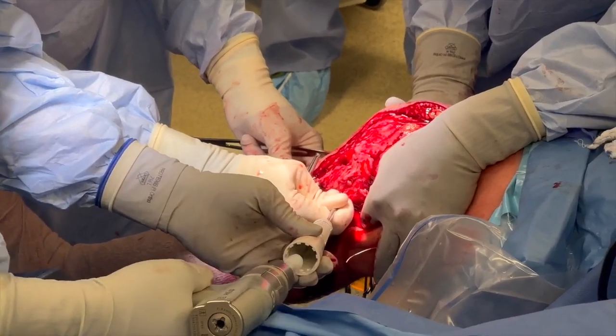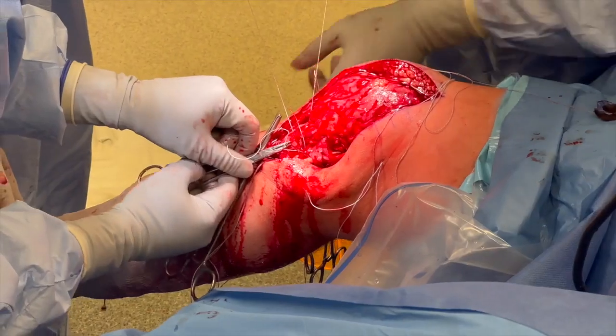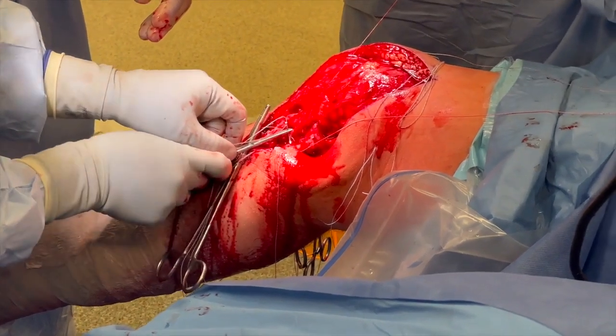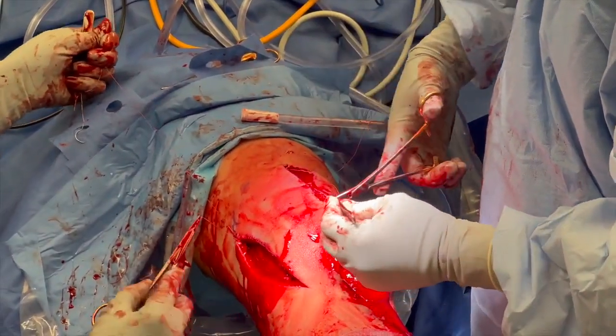To reconstitute the proximal soft tissue tibial attachment of the MCL, a Q-fix anchor is placed 15 mm distal to the medial joint line. The MCL allograft is sutured to the Q-fix anchor with the knee in 30 degrees of flexion. Knee stability with the restoration of the valgus stress and anteromedial drawer test is validated one last time. The tourniquet is let down, and the deep and superficial tissues are closed with suture.